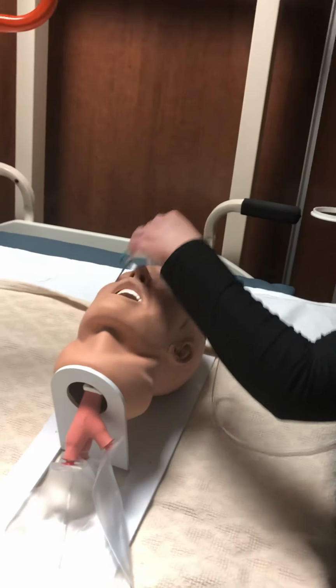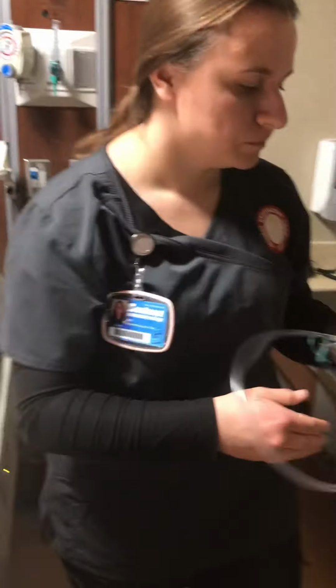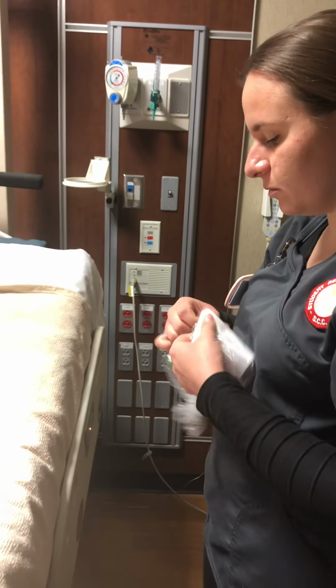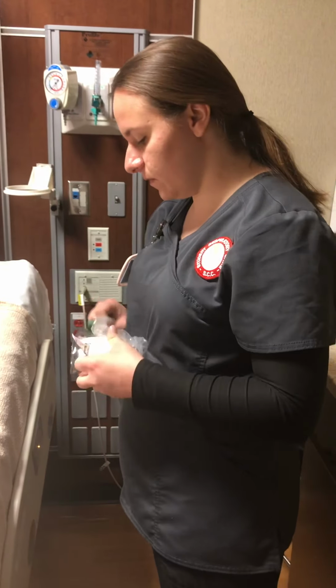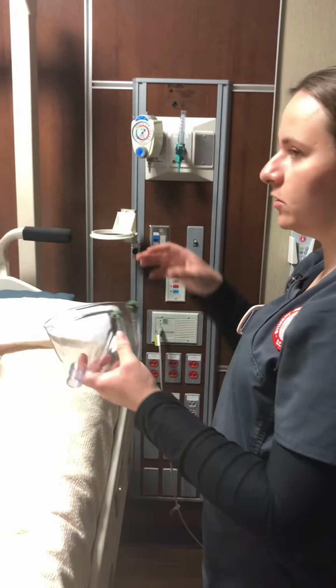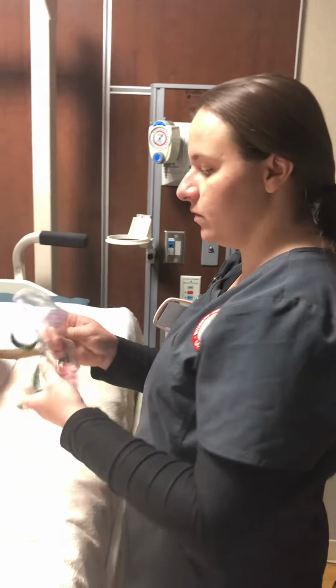I'm going to get this one off of the patient. I'm going to remove this patient here. And with the face tent, you'll have corrugated tubing with the face tent. So I have my corrugated tubing connected to here and to the humidity device and the O2 device.